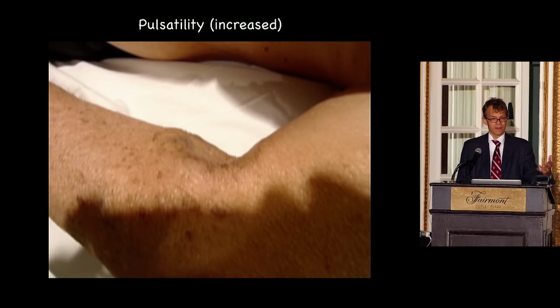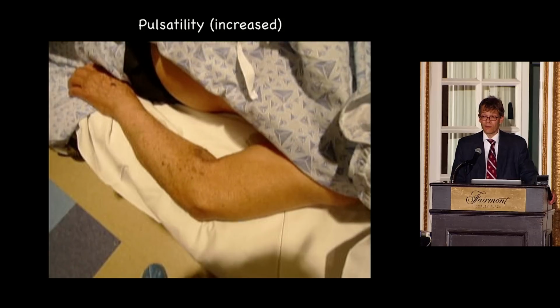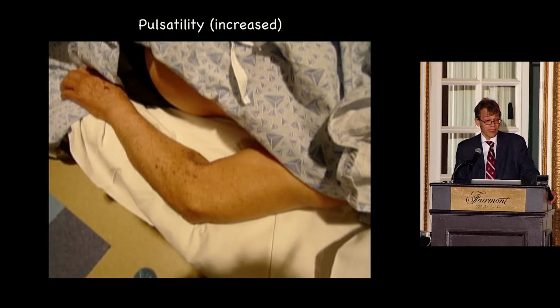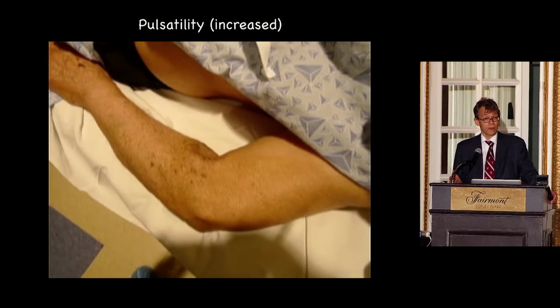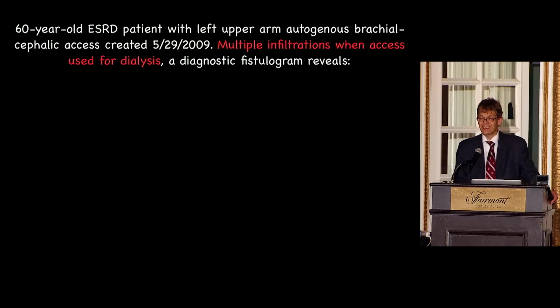We have measured it. Normal access pressures, we like them to be between 25 and 35 millimeters of mercury inside the access. You can actually measure static pressures on the dialysis machine. It's a protocol that is not that simple, but it allows you to get an answer if you have a question, well, is the pressure high? Is that why my aneurysms go so large? That you can get that.